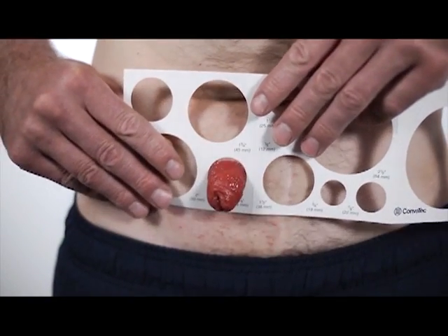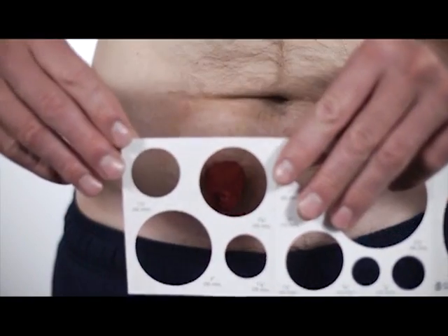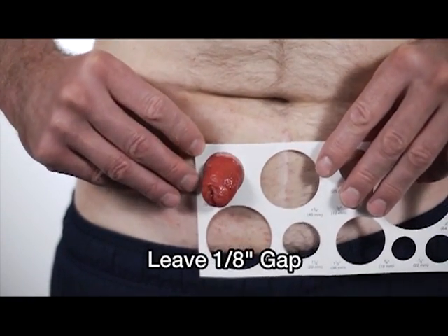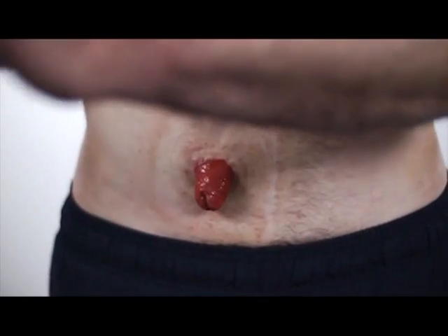When using a moldable wafer, use the exact measurement size of your stoma. For a cut-to-fit or pre-cut wafer, you want to choose a size that has an 1/8 of an inch or 3 mm gap around the stoma. If you recently had your surgery, it is important to measure your stoma each time you apply a new pouch.